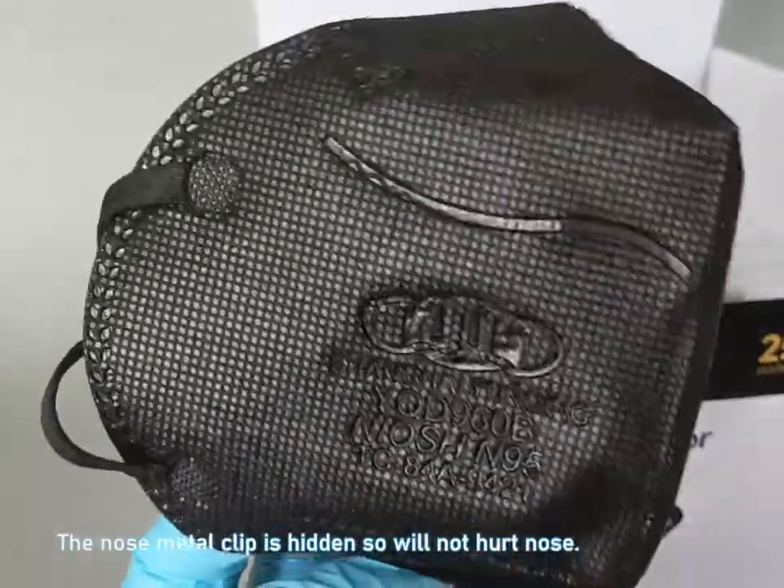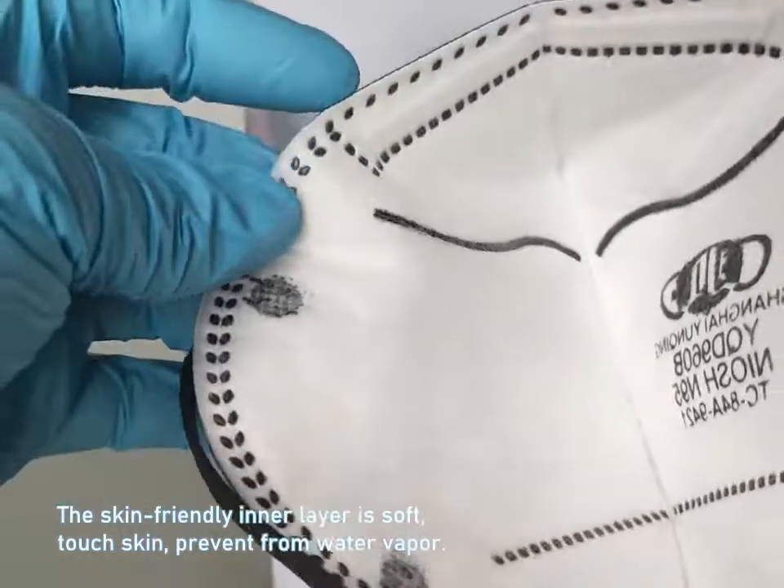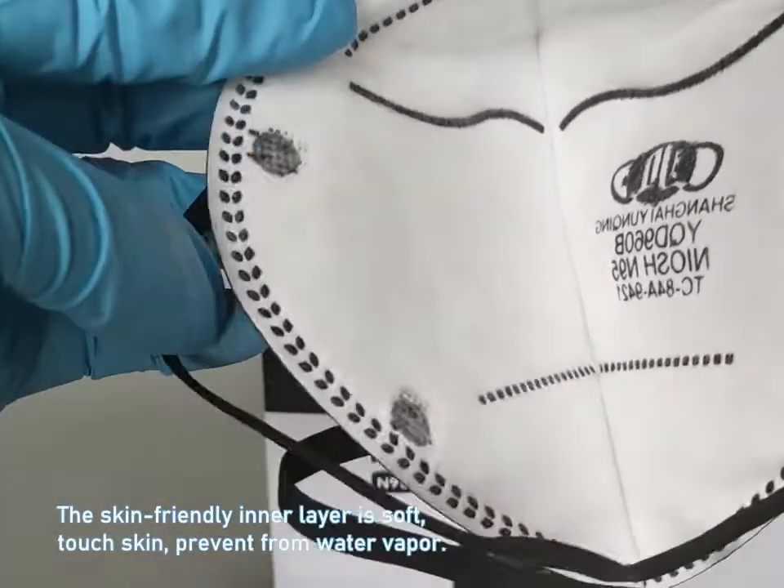The nose metal clip is hidden so it will not hurt the nose. The skin-friendly inner layer is soft, touches the skin, and prevents water vapor.